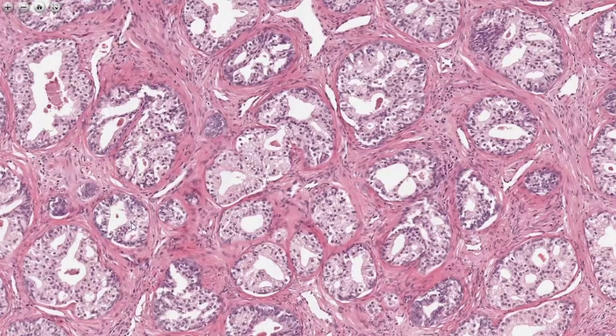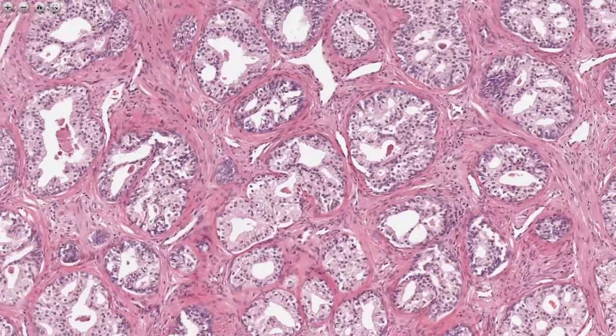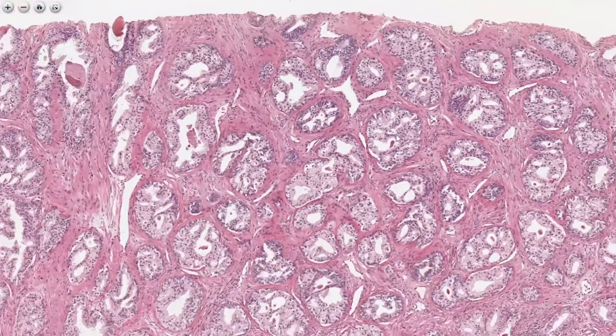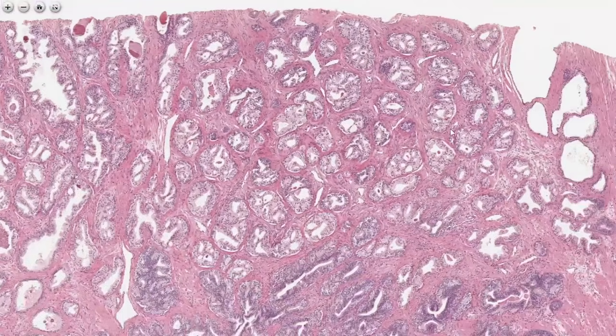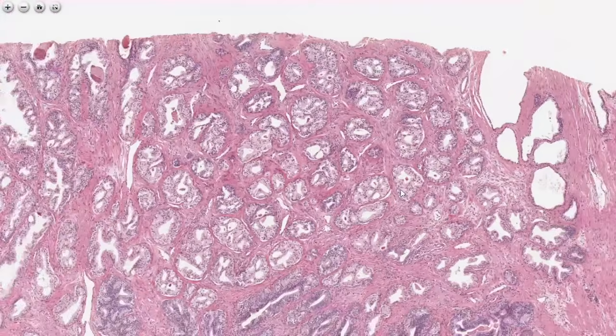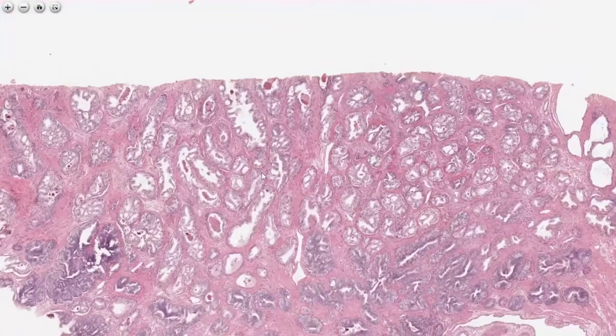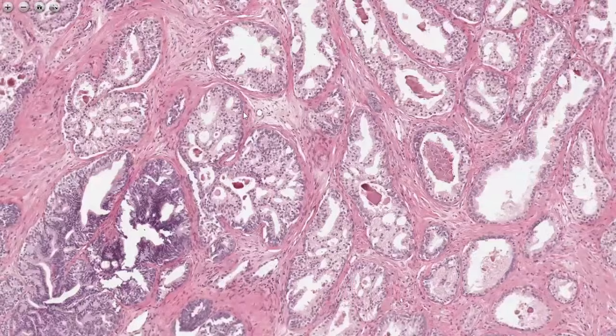You remember in breast, atypical duct hyperplasia has this thin connecting rim. This is not ADH, but I am just drawing comparisons here. See, there is also a thin rim that is connecting it. So this is clear cell or cribriform hyperplasia that is present, along with basal cell hyperplasia in this lesion. These two are completely benign entities and often coexisting, right? So these are all clear cell cribriform hyperplasia changes.